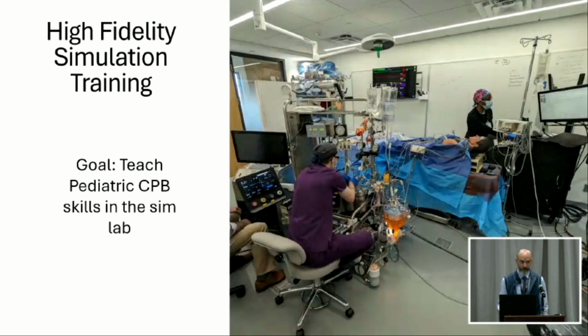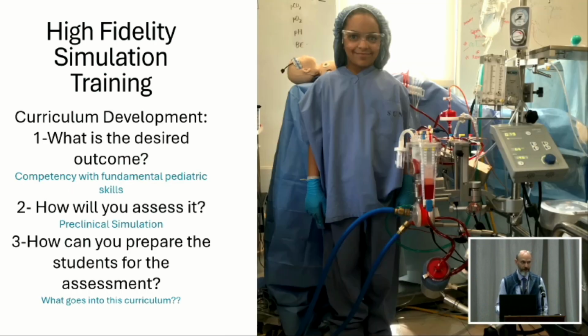And that brings me to, we do a lot of simulation for training perfusion skills. And we had an interest in teaching pediatric perfusion. So the way you go about building a curriculum is to understand, what is the desired outcome. In this case, we would like to teach competency of pediatric perfusion skills, and particularly the fundamental pediatric skills, and how are we going to assess it? Step 2 of writing a curriculum. We're going to use preclinical and simulation. So put them in that environment. We want them to reach a certain level of competency before they ever touch a patient.